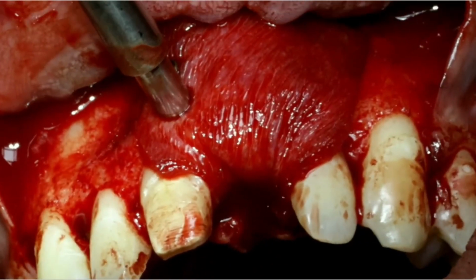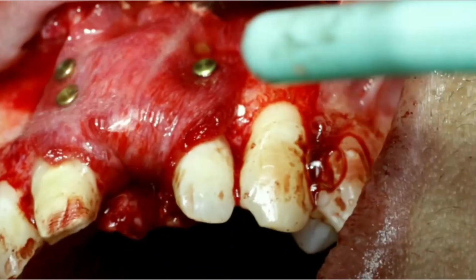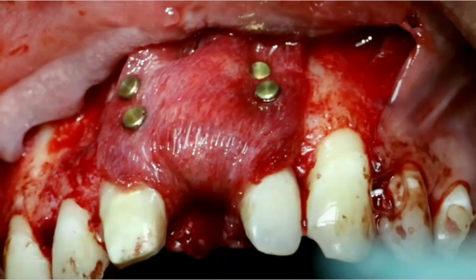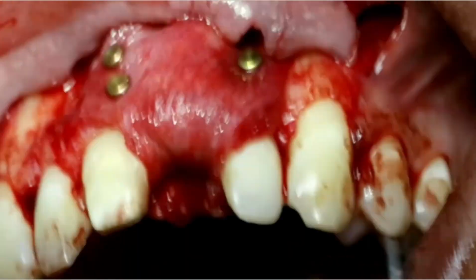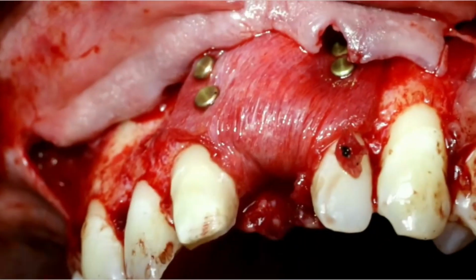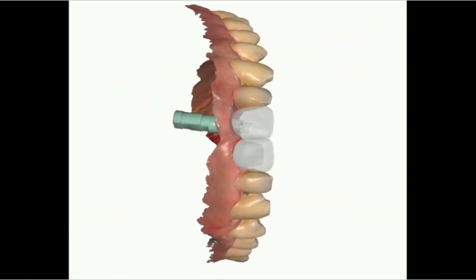Bone stability and membrane fixation. Here is tension-free primary wound closure, and after that, we start the prosthetic phase.